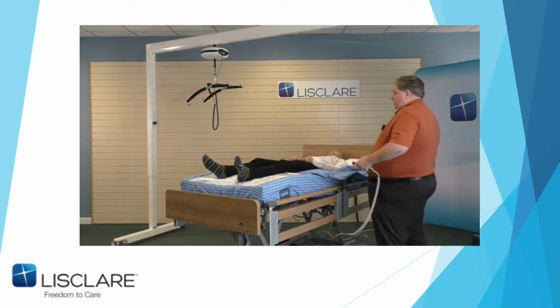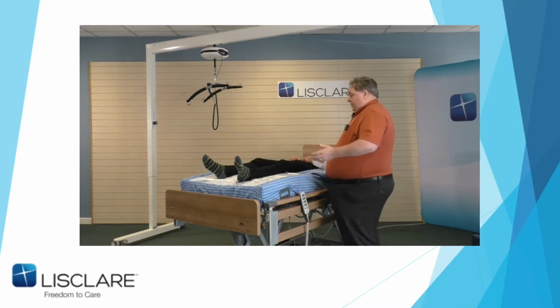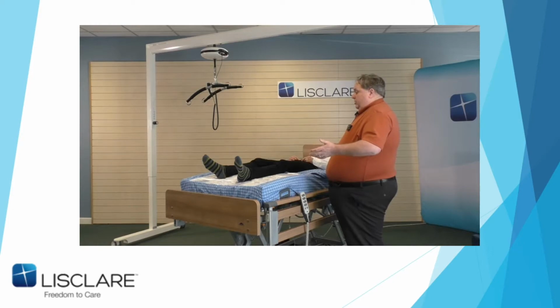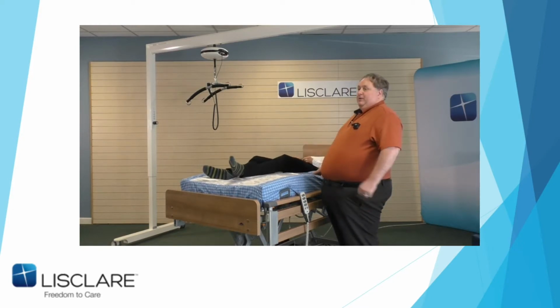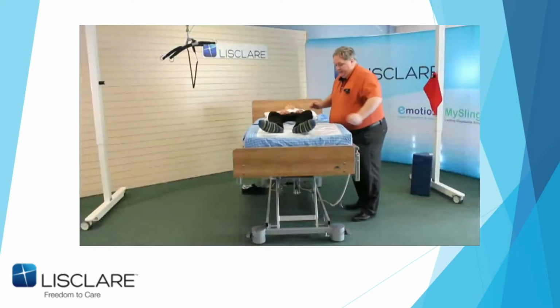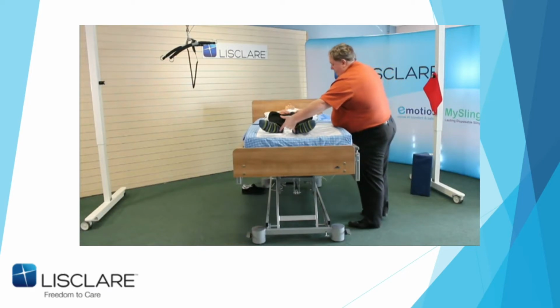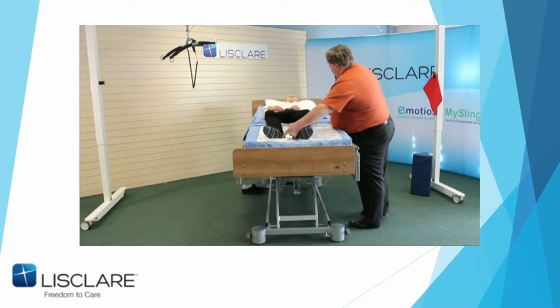Now I'm going to use the backrest motor on its own. Now, again, because John's such a fitness fanatic, he finds this challenging. But I learned this through a muscular dystrophy condition. John, he's learning. He went straight into that motion. So I asked the person to lose the tone in their knees. And if I stay here and raise the backrest up, and I keep my fingers there, if John can wiggle his shoulders a bit, he will naturally slide up the bed.